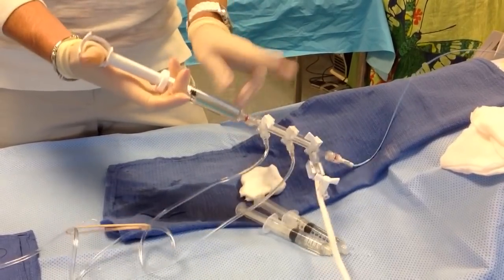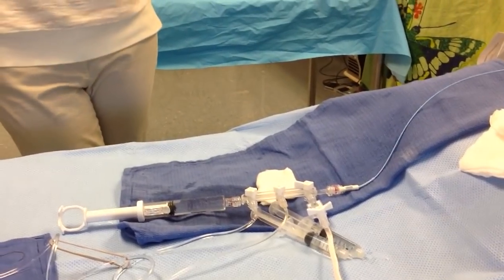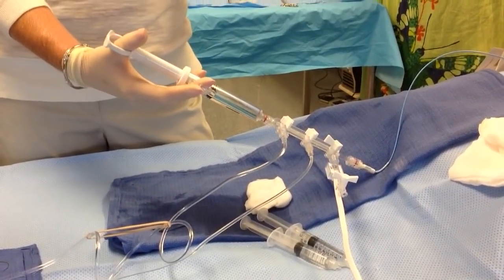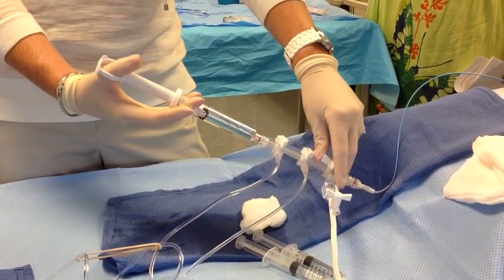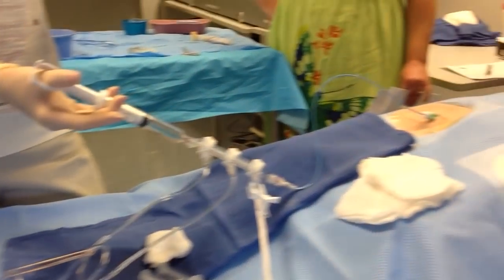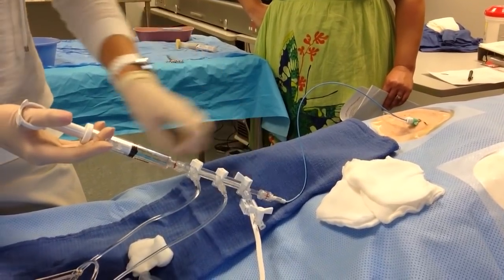Okay, so I have my contrast. So now they're going to record AO pressure. So when they're finished recording, they'll say finished recording. After you do the flush. Yeah, because you want to clear the catheter out. Because if you don't, then it could dampen the pressure. Yeah, if there's an air bubble or something in there. So now I'm just going to do a test, which is what? 1 to 3. So I do 1 to 3 mLs, and we see it on the screen. If it looks good, then we're going to take our pictures.